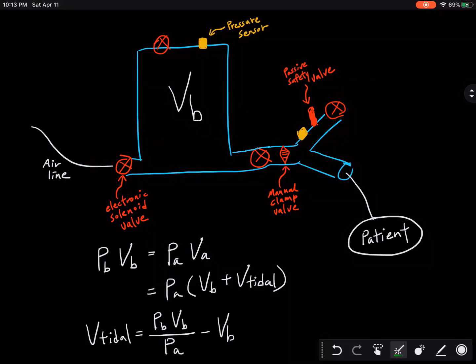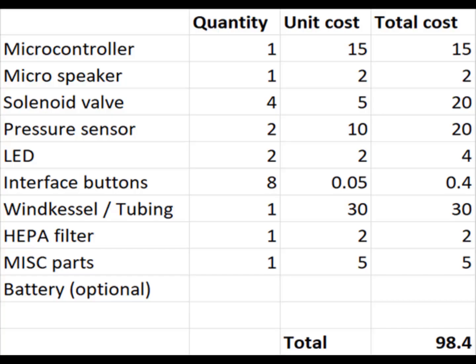This design has no moving parts, which makes it more reliable and robust compared to many other low-cost ventilator designs involving mechanically squeezing a bag. This is the entire parts list. The construction is very simple. Most of the complexity in this design is in the control algorithm, which once it is developed can be directly uploaded into the microcontroller. Since the electrical power requirement of the design is very low, if needed, the device will be able to operate on battery for many hours.